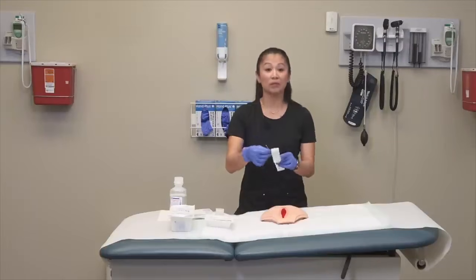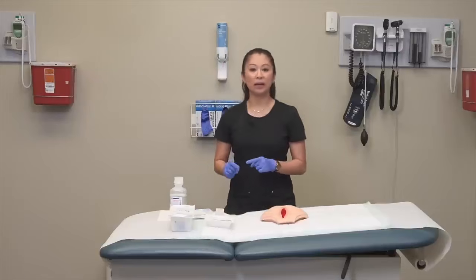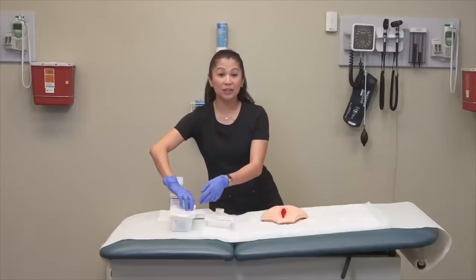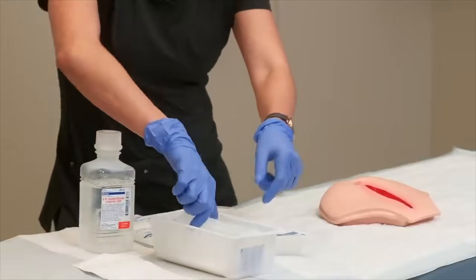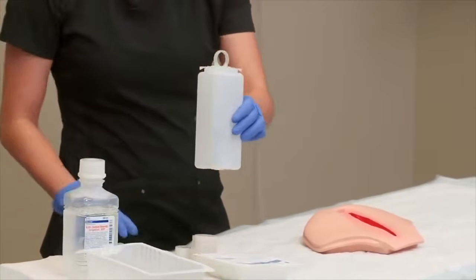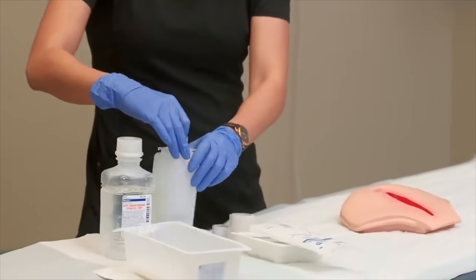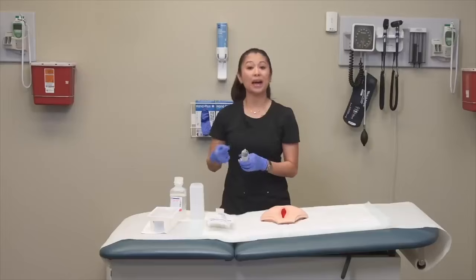Let me go ahead and get rid of this. So once I've done that, we can go ahead and pour irrigant solution into the canister. I've got this really handy irrigation tray here. I'm going to move this a little bit out of the way. The nice thing with this is it's got a container here for me, and my catheter syringe is in here to withdraw the fluid.